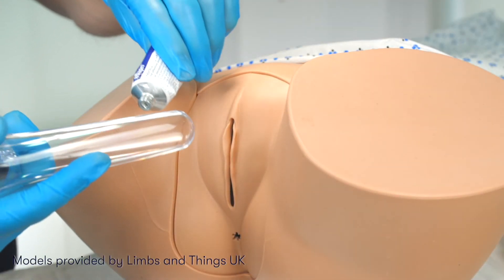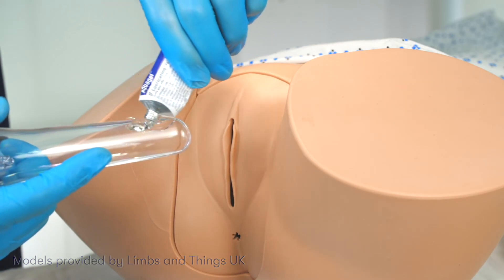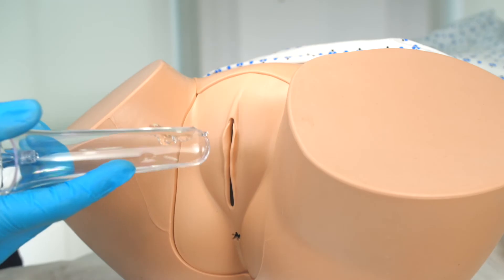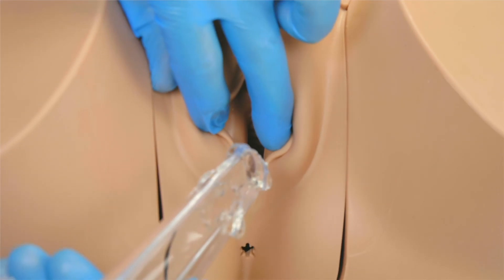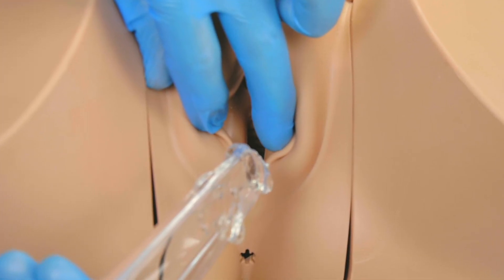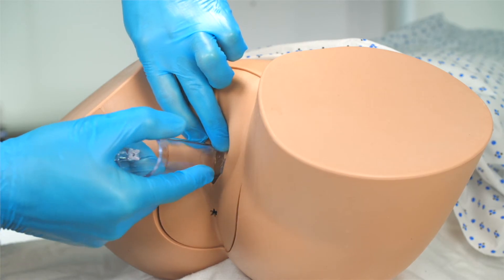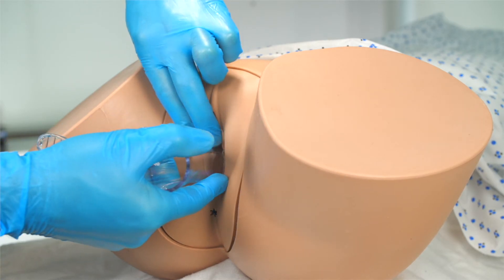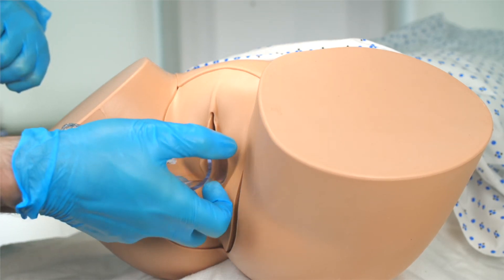Next, we may warm the speculum under running water, before lubricating it with water-based lubricating gel. Using our left hand, we gently open the labia minora so that we have a good view of the introitus. Holding the speculum in our right hand, with the blades closed and the handle pointed towards us, we gently insert it into the vagina, with the speculum angled downwards and backwards to match the angle of the vagina.